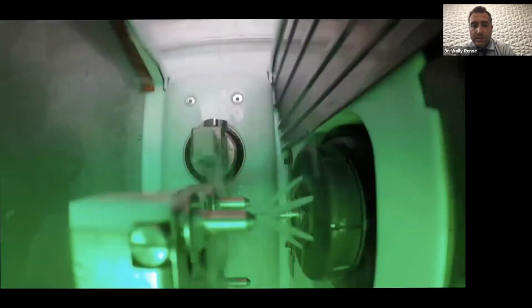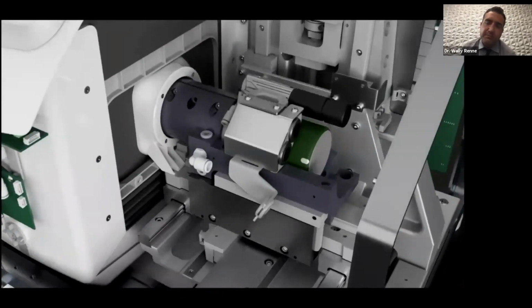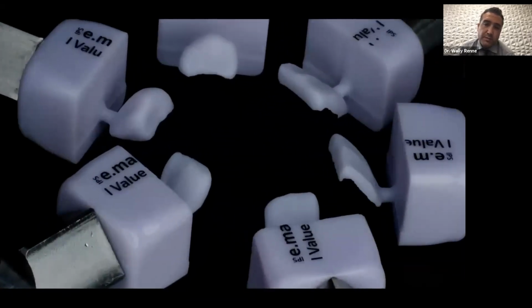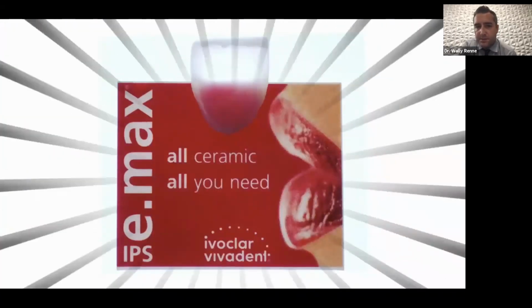They're very, very thin. And so here we're going to mill them out. In this case, we're milling in the 30S mill. For those who don't know, that's PlanMeca's flagship mill. It's really cool because it has these direct drive linear motors. What that means is no chatter, so you can mill things super thin like this and not get chipping. They have awesome technology when it comes to their chairside mills.